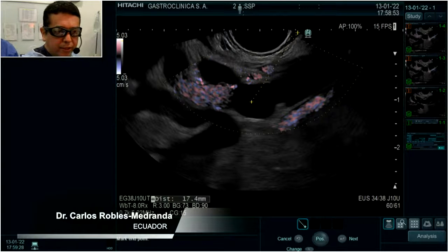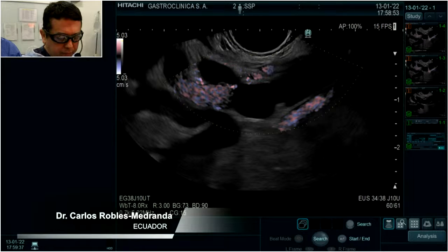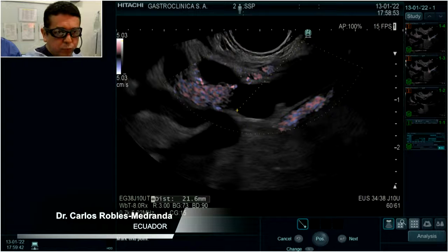because what I see here, I have 18, almost 20 millimeters. I will measure again. Let me see. 20 millimeters, yes, but the dilation of the biliary tract is almost 10 millimeters. So I am thinking probably also to use an axios to drain here and to have an axios directed to the stomach. So in this situation it will be better. Okay. So I don't know.